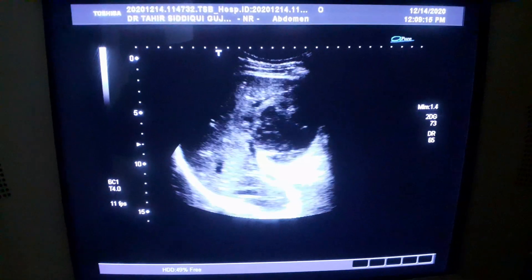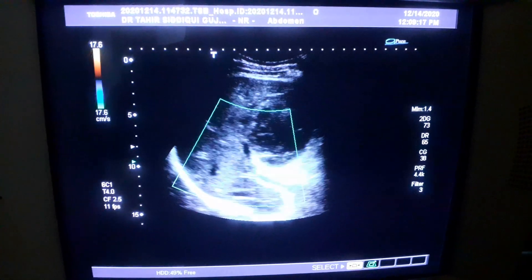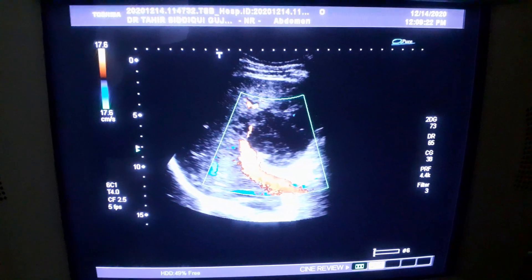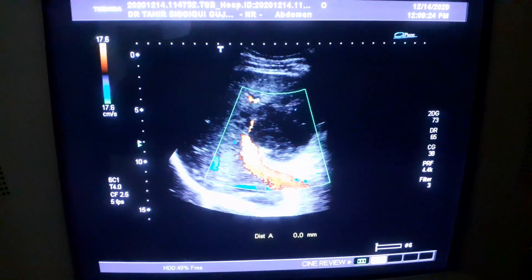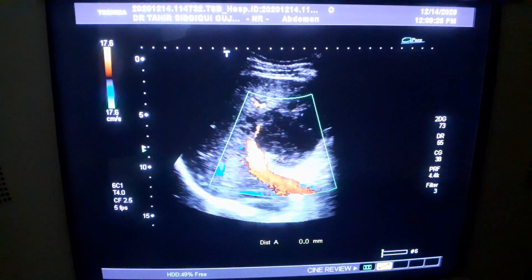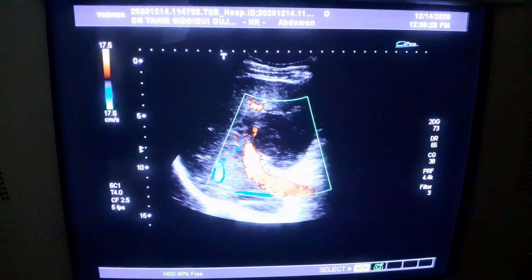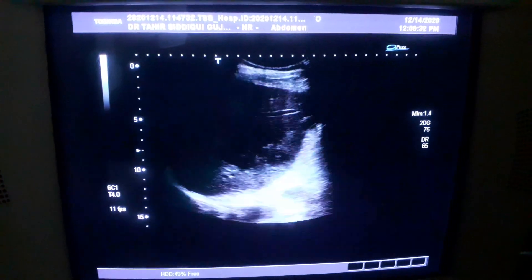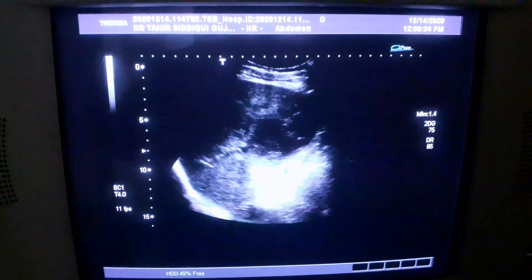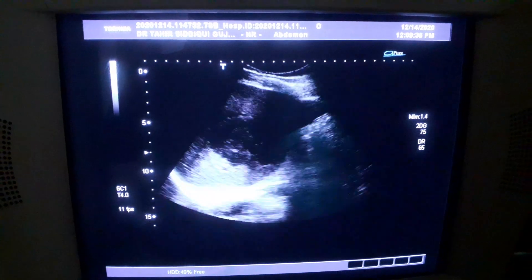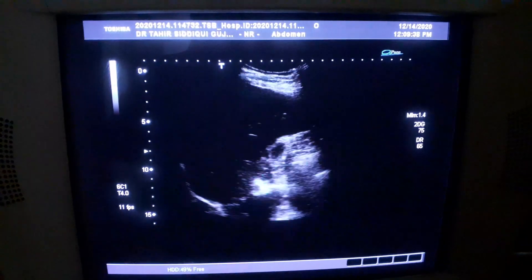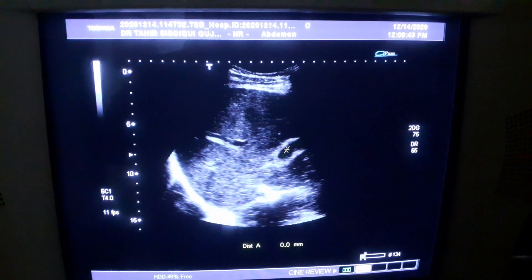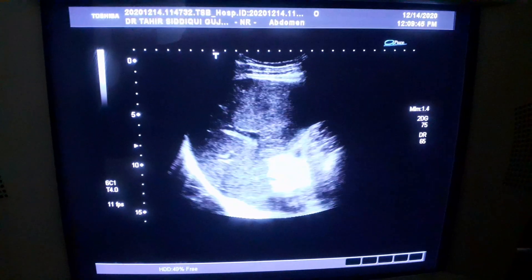Now there is a cystic area. You see this is the portal vein, and this is the cystic area in the right lobe of the liver, with the gallbladder seen on it. You see this is the gallbladder here — so the cystic area is separate from the gallbladder.